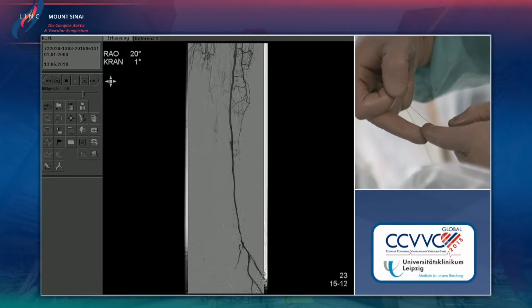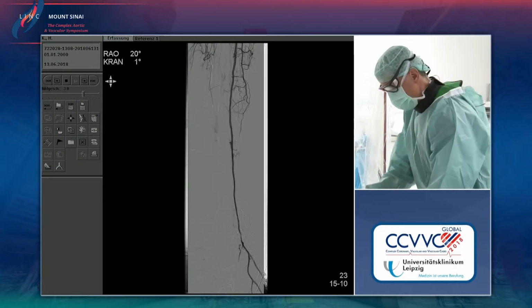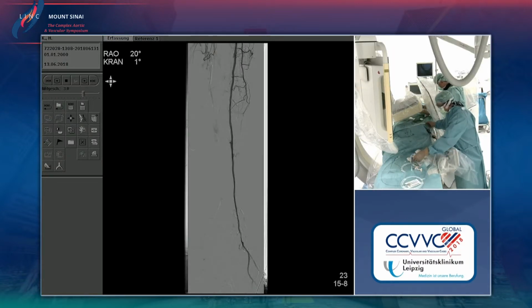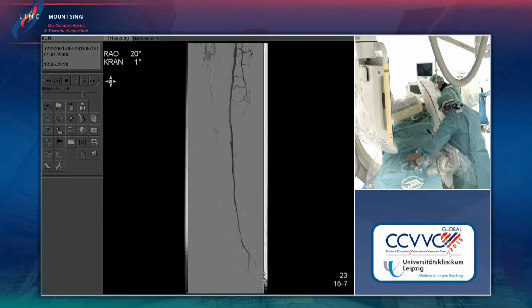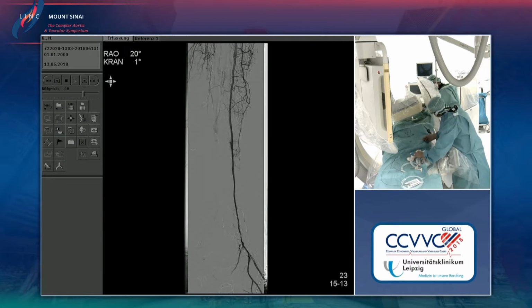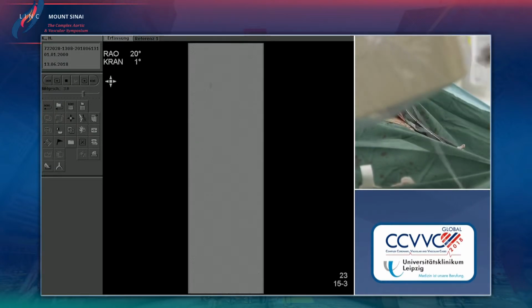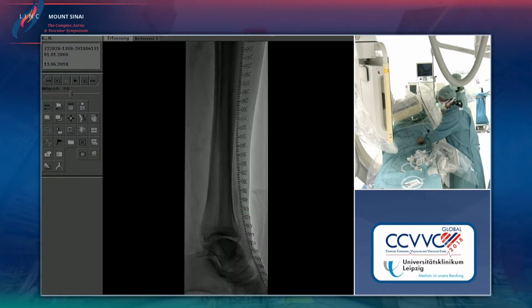So if you are in a subintimal channel, do you have any concern that by injecting a given volume of this drug, this volume might result in some compression of this subintimal lumen? Did you observe something like that already? Well, theoretically, yes, but actually we have never observed it. It's, I would say, not 0%, but very rare that you have to post-dilate after using the bullfrog device.